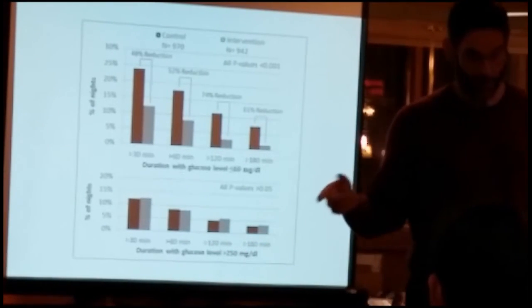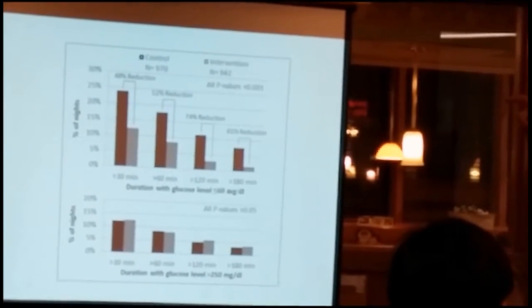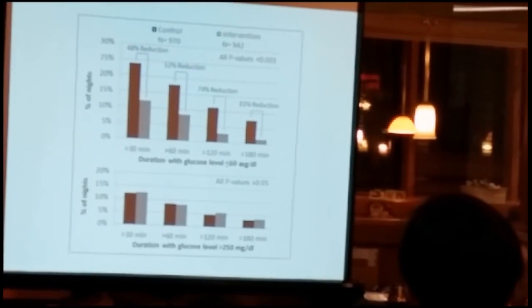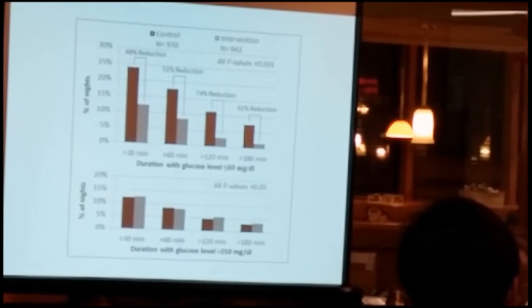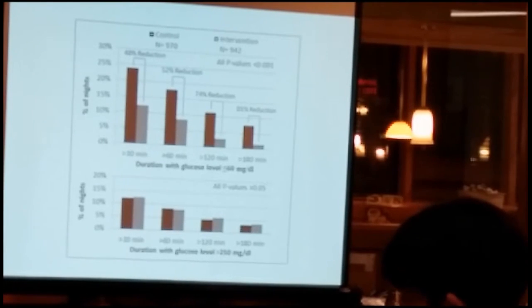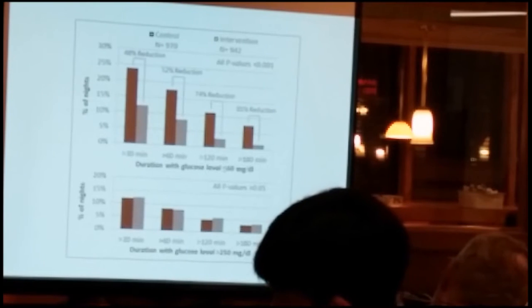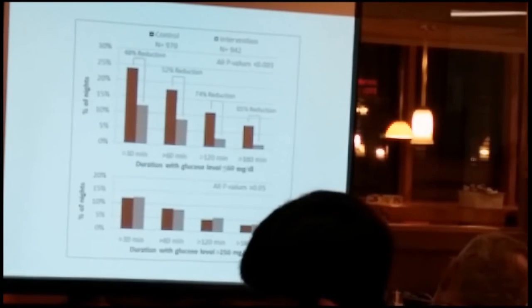So back to your question of now, is this going to work in different age groups? We are now repeating this study. We're almost done with the 11 to 14-year-olds. And this was almost 2,000 nights of people in their home. This wasn't locked up in the hospital. They were at home and had the system. So we're almost done with the 11 to 14-year-olds, and we just finished the first 200 nights of the 7 to 10-year-olds.